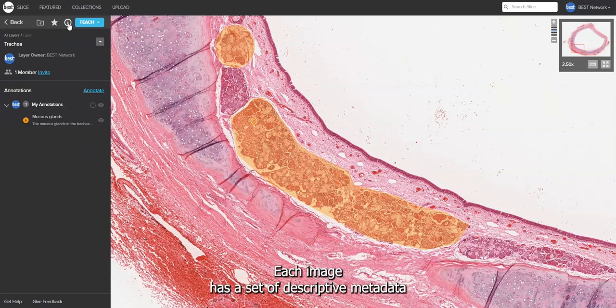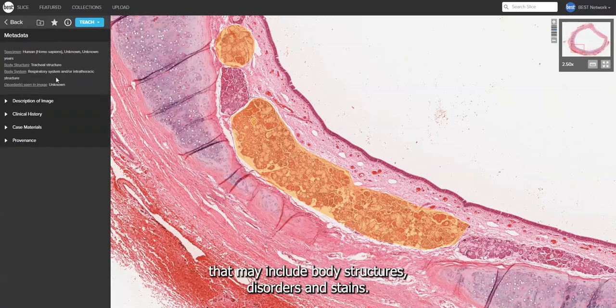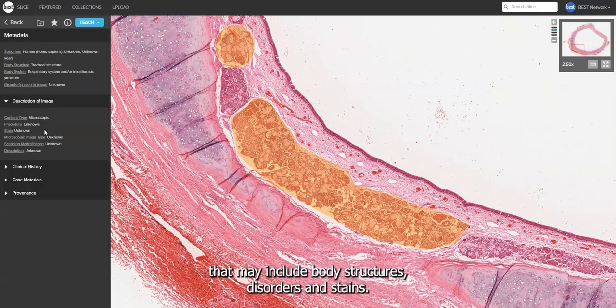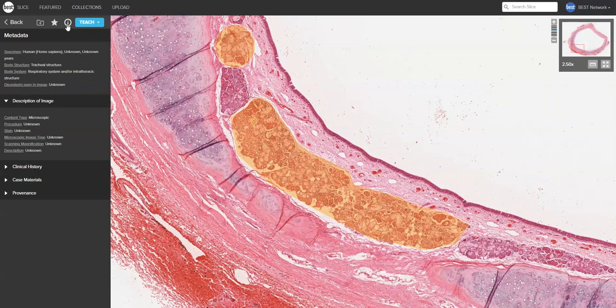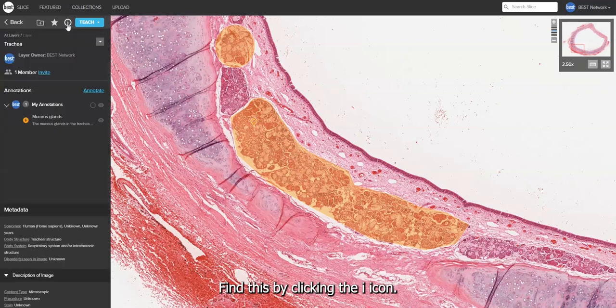Each image has a set of descriptive metadata that may include body structures, disorders, and stains. Find this by clicking the eye icon.